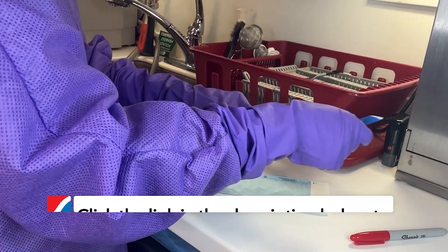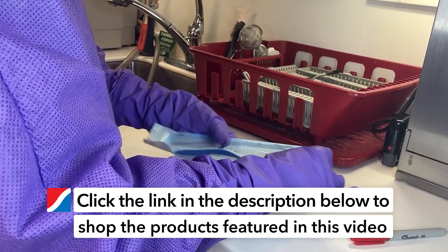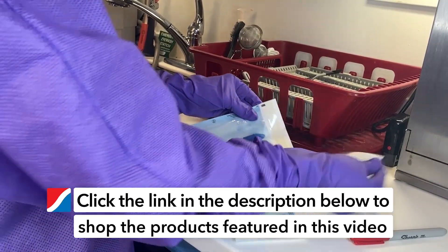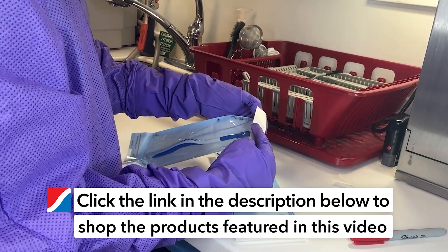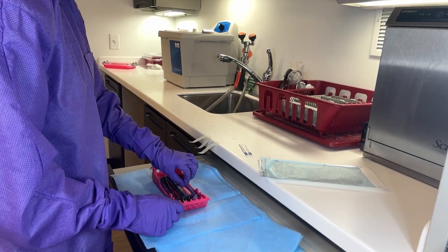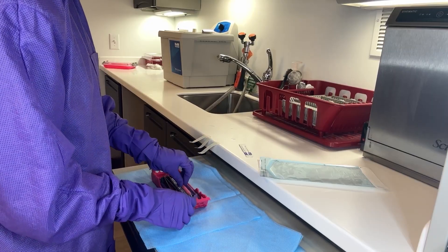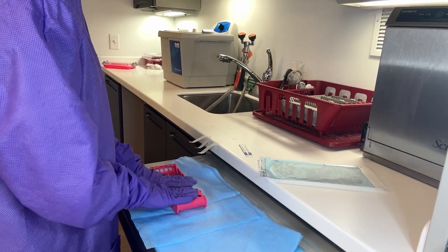After inspection and ensuring the instruments have fully dried, package the instruments for sterilization. Packaging materials should be chosen based on the type of sterilization process you will use. Typically, you will be using sterilization pouches or wraps that allow the sterilant to penetrate while maintaining the sterility of the contents after the process.